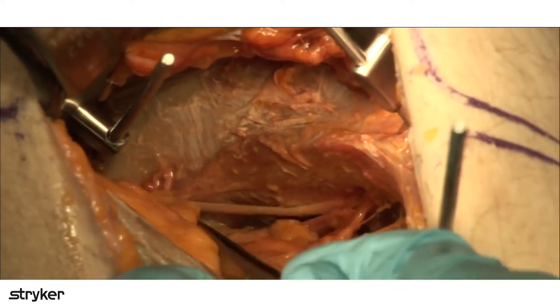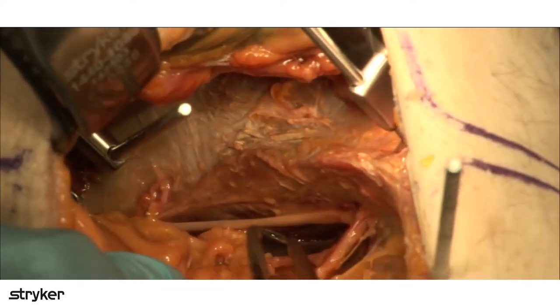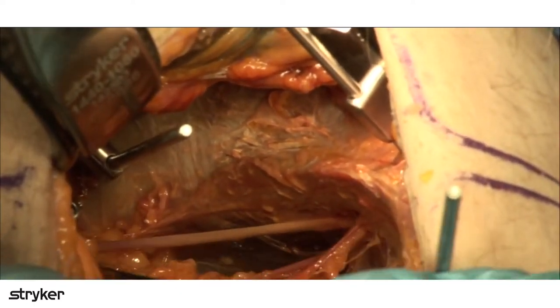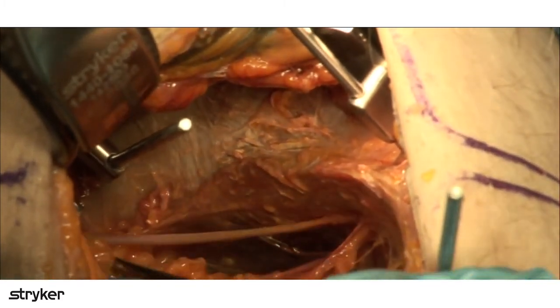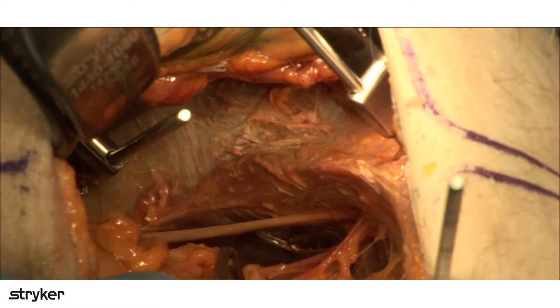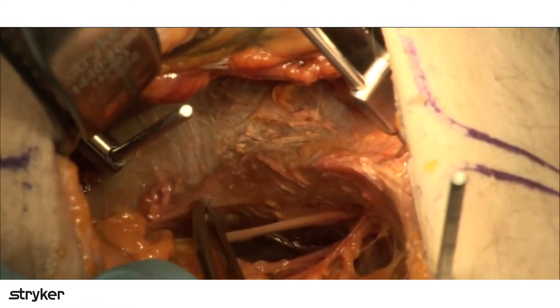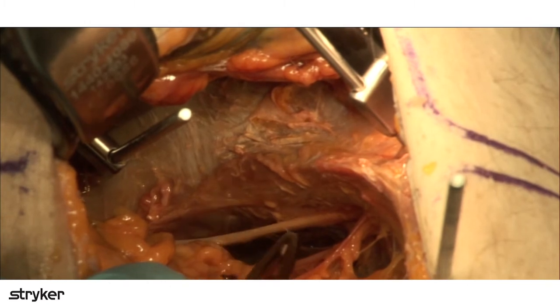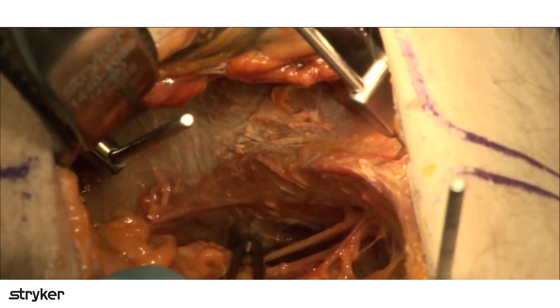The other part that Pierre Guy likes to talk a lot about, and that is also really important, is releasing and tracing the obturator nerve up as proximal as you can get it. Because what this now allows you to do is work on both sides of the obturator nerve. When you're up here, you're going to be medial to the nerve. And then as you work your way down the posterior column, at some point you're going to be stretching the nerve too much. You see that?